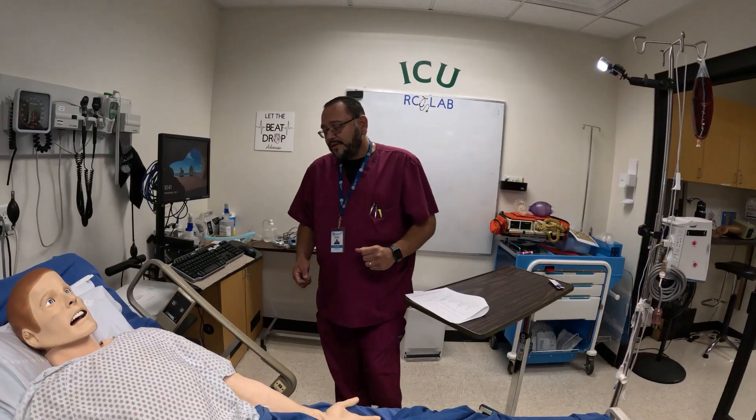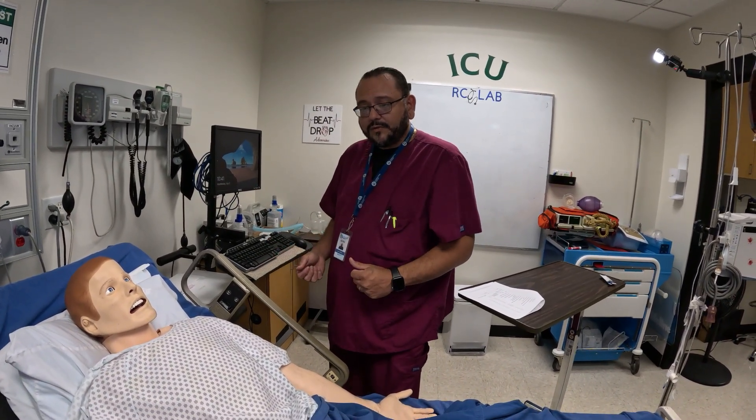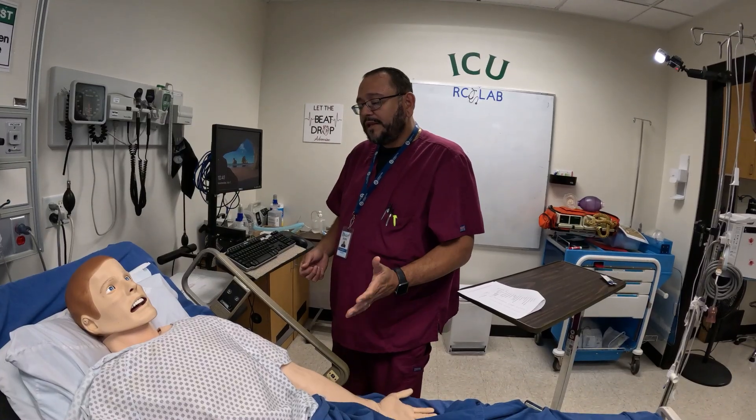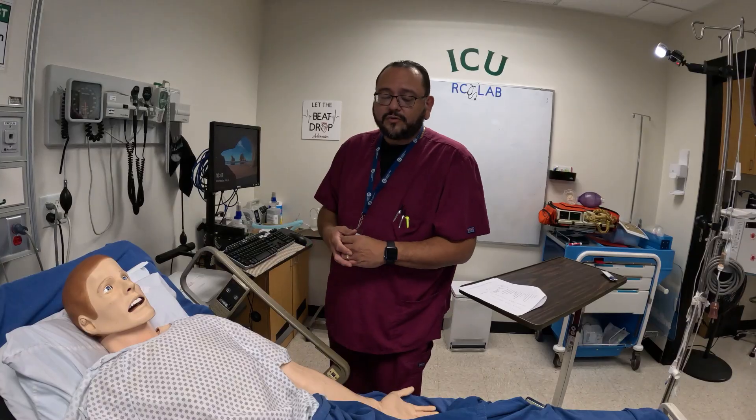Thank you, Mr. Smith. Is there anything else I can do for you before I leave? Any requests he has, I'll try to accommodate. And then I will let him know if there's another treatment coming — that I'll be back at whatever time to administer another treatment.